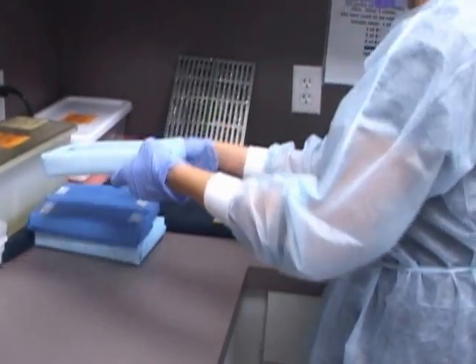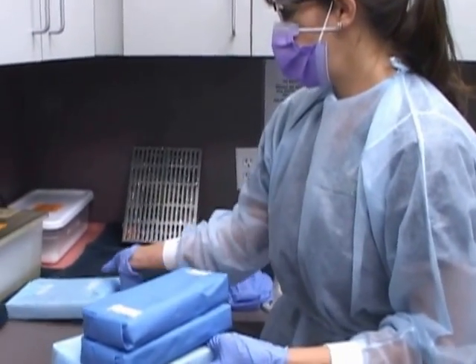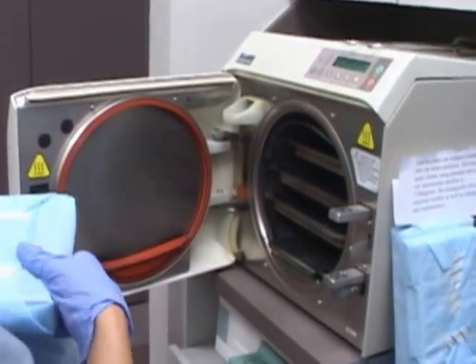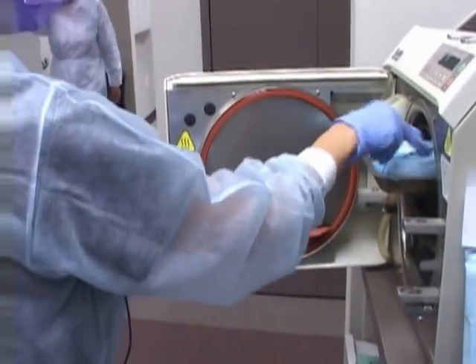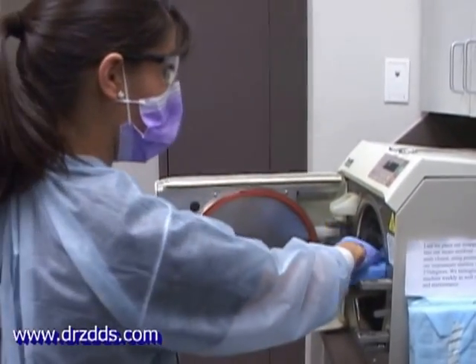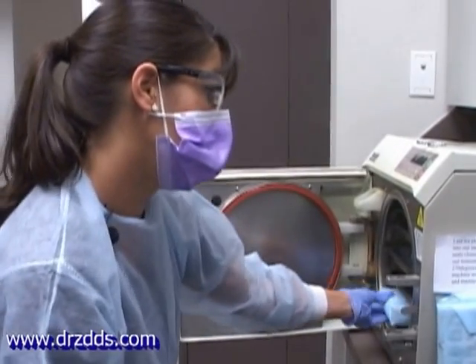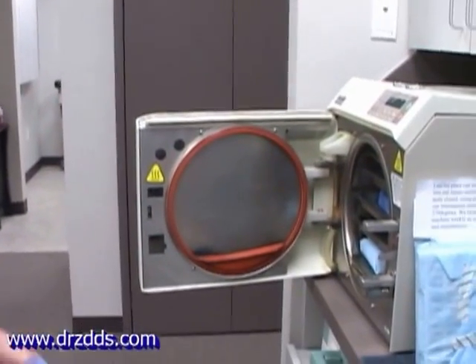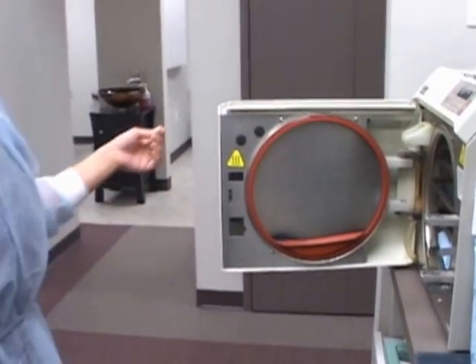Then our wrapped cassettes are placed into our steam sterilizer. This machine seals closed using pressure and heat. Our instruments sterilize at 270 degrees. We biologically test this machine weekly, as well as cleaning and maintenance.